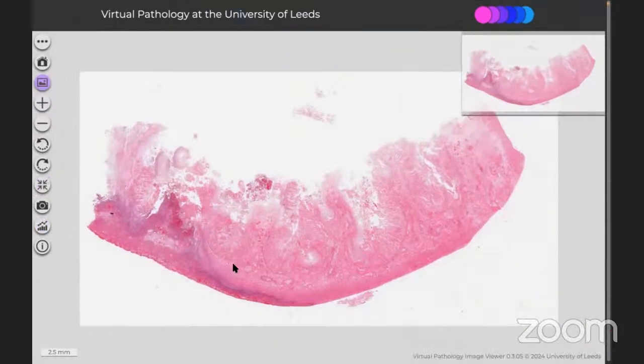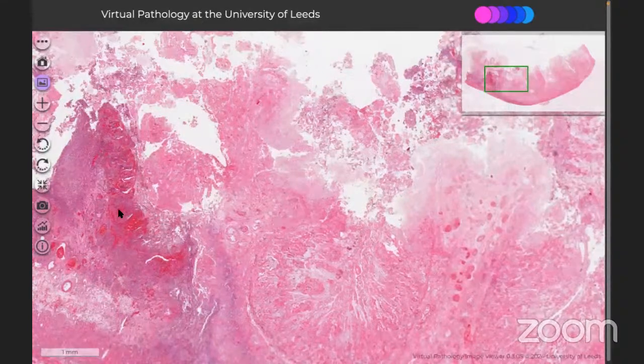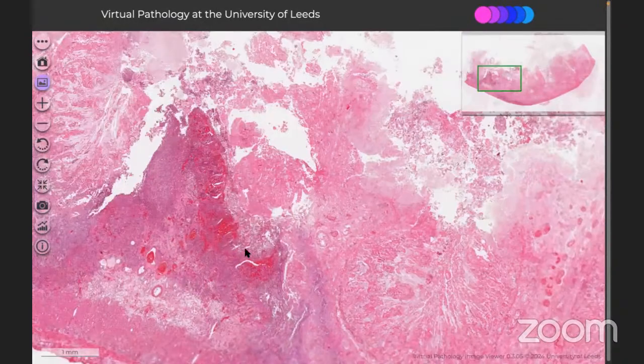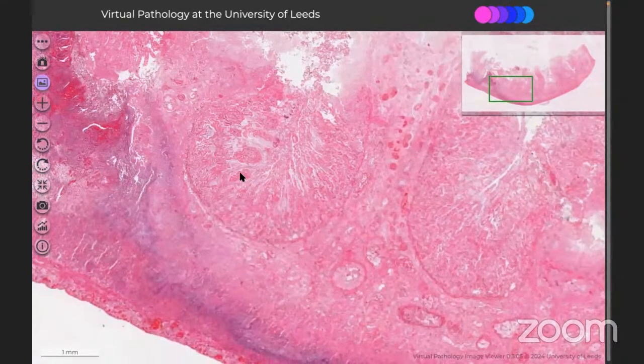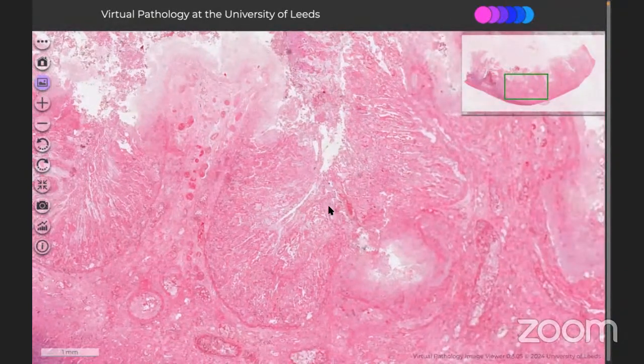So this is the section from the small bowel, and from the lower magnification, we can see it is showing an ischemic pattern of injury. The surface epithelium is completely denuded. There is no chronicity in this. There is no fibrosis or altered architecture, particularly in this section. So all the mucosa is being sloughed off. There is a significant amount of hemorrhage. It is a top heavy kind of appearance, which is significant for acute intestinal injury, ischemic kind of injury.